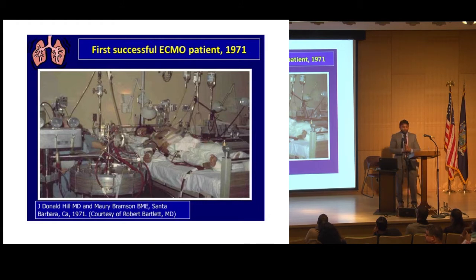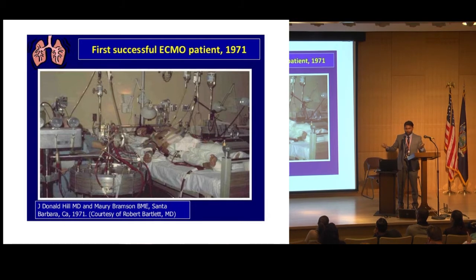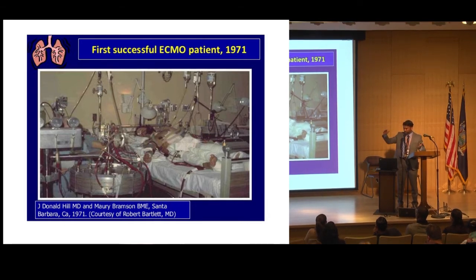There were some folks, especially Philip Drinker, who used something like a silk screen that would differentiate the blood and the oxygen. And then at that time, something was also discovered, what we call silicone rubber, right? Silicone was known to have a characteristic which would allow permeability of O2, and that was used in this machine. So anyway, just to give you an idea, there's a lot of work that goes behind, and we should be very grateful for what we have these days, right? So it's important to know history and the evolution.